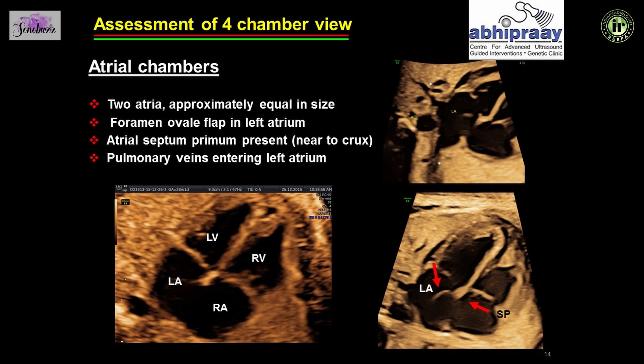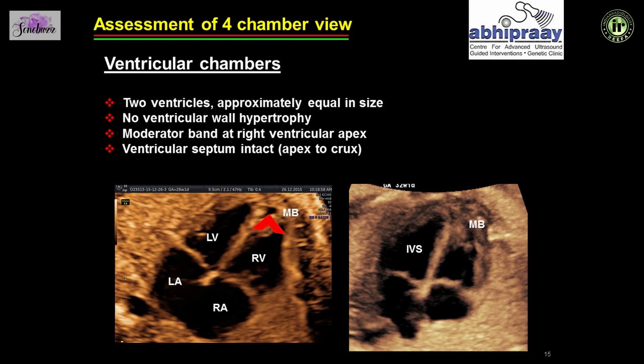Looking at the four chamber view, you assess the atrial chambers — there have to be two atrial chambers of approximately equal size. The foramen ovale flap opens into the left atrium, the inter-atrial septum has to be seen, and the pulmonary veins enter the left atrium. The ventricular chambers in fetal life have to be approximately equal in size with no ventricular wall hypertrophy. The moderator band is seen at the right ventricular apex, and the interventricular septum has to be intact from the apex up to the crux of the heart.